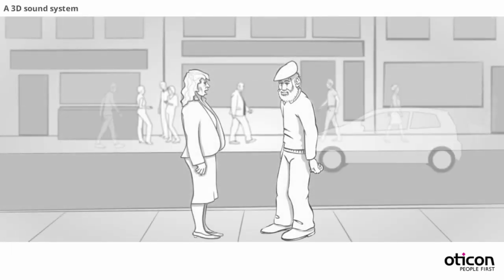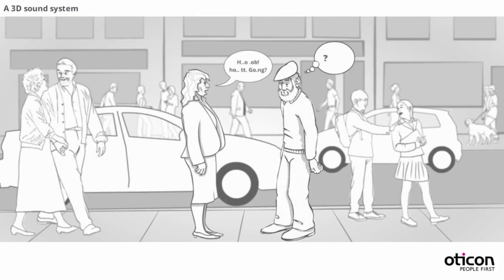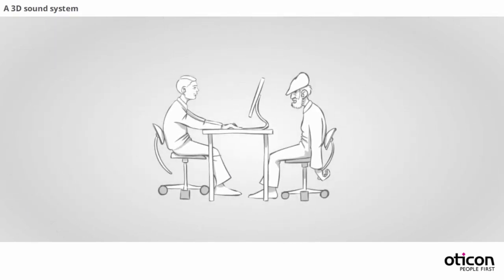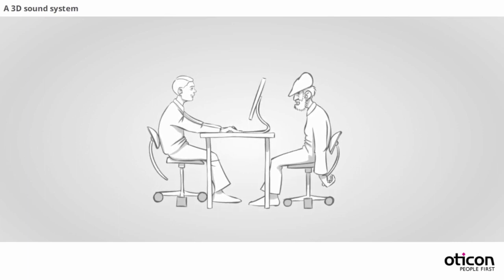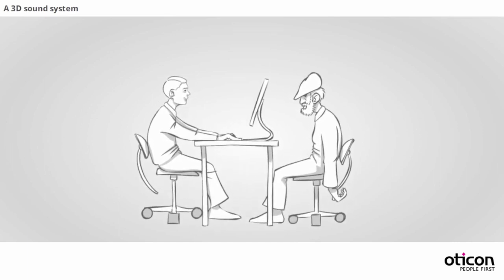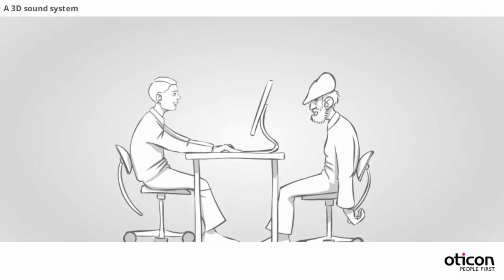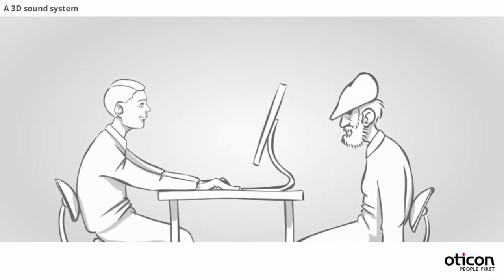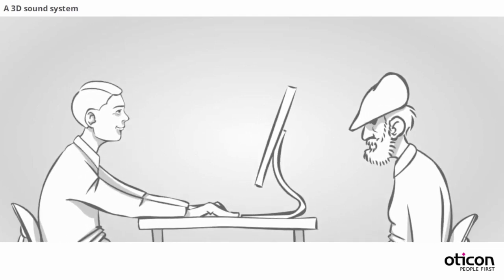Background noise can interfere with your client's ability to hear, understand, and pay attention to what they want to hear. A hearing aid fitting is usually done in quiet environments. However, this does not allow users to experience the hearing aid in complex listening environments with multiple competing sound sources.